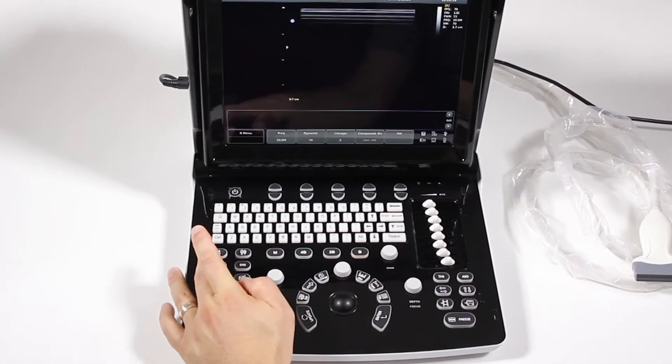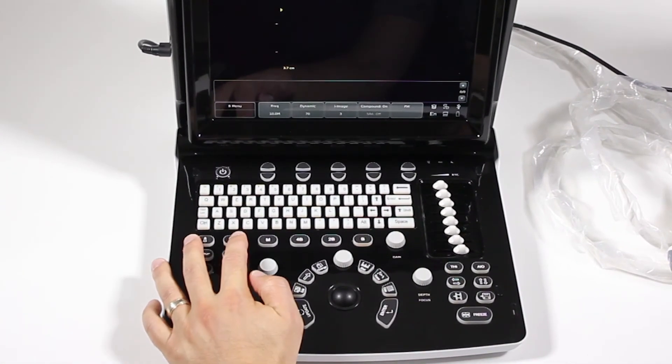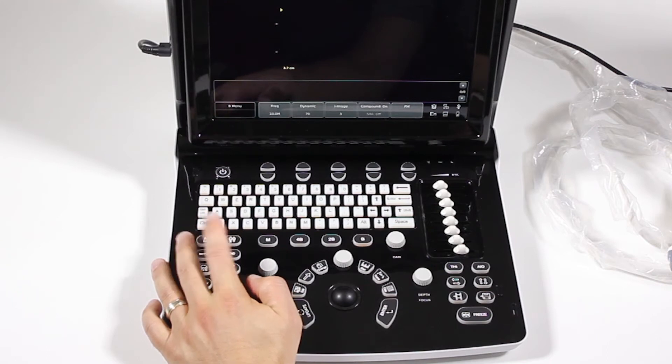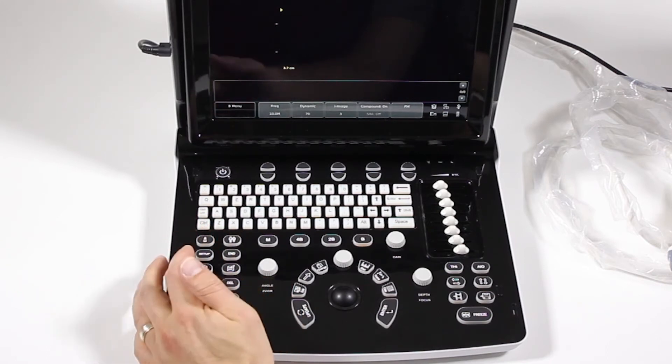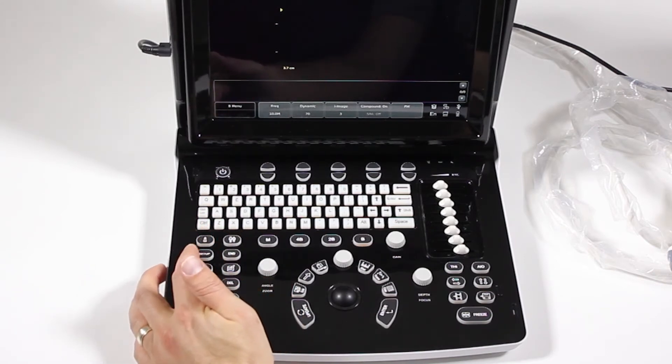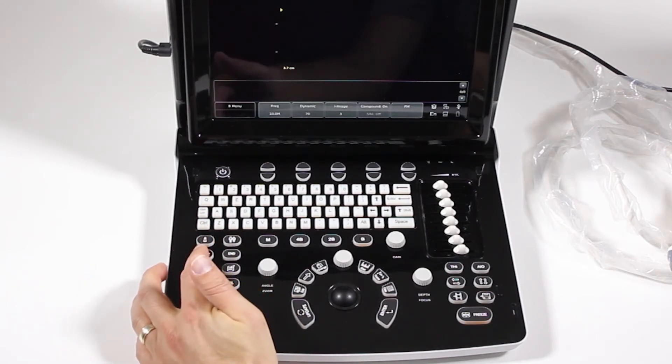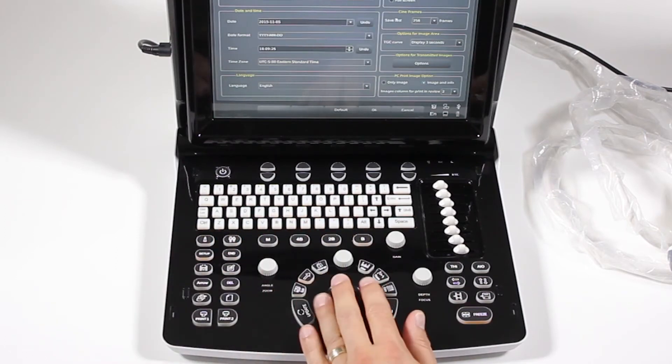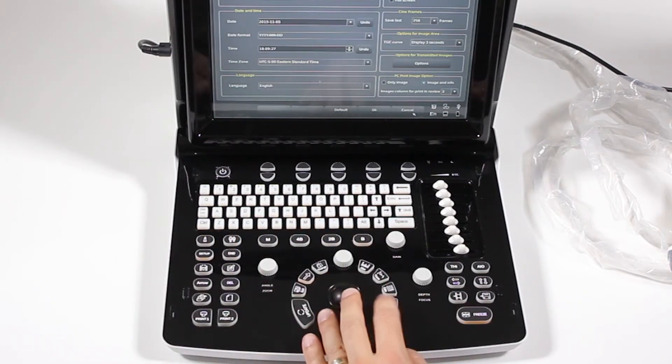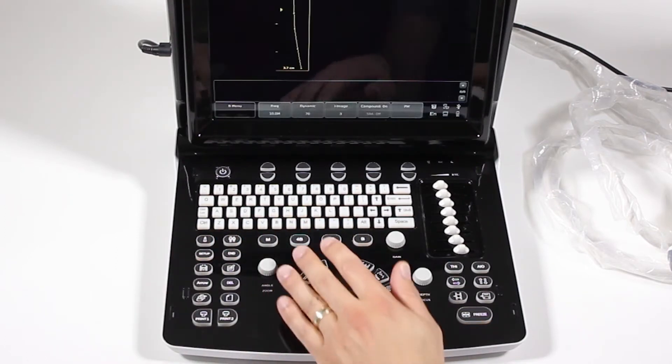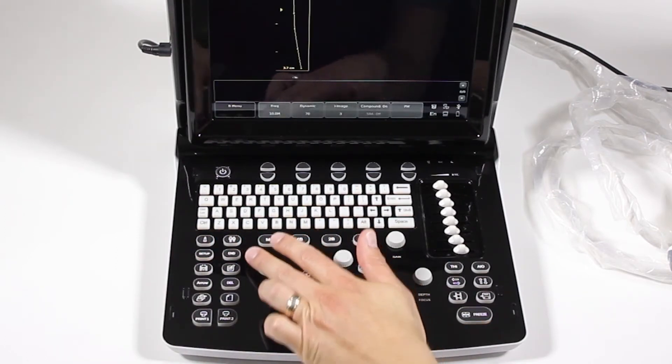We have your probe select here. We have our patient key here, so we'll get into that in the next chapter as well. System setup will take you into the system customizations menu, and we'll get that into a later chapter.